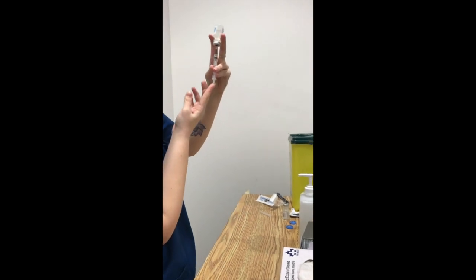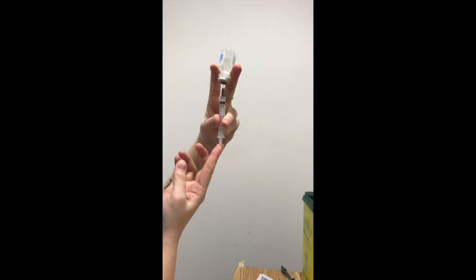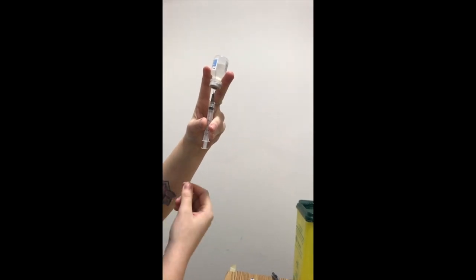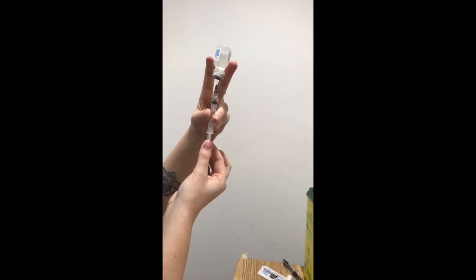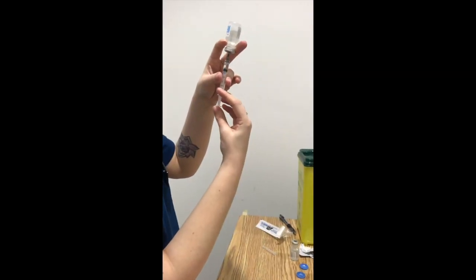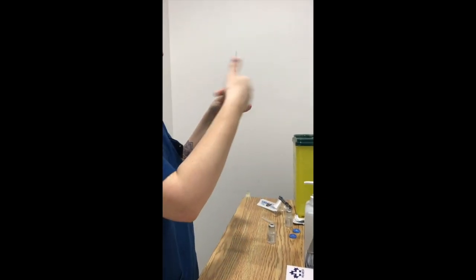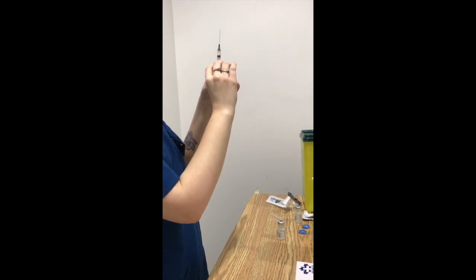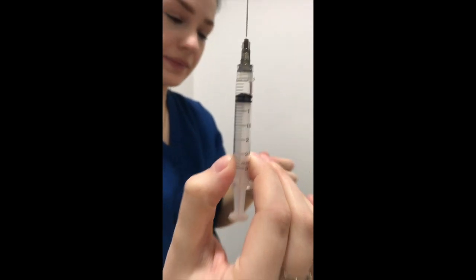And then we'd want to make sure that the tip of the needle is below the level of the fluid. So you can see that the level of the fluid kind of stops towards the top, and then the needle is below there. Then we're going to let go of the plunger and let it pull back by gravity a little bit, and then we're just going to help it along. So once we're at the 0.5 mL, we can just pull back on that. Tap out any air bubbles. Make sure we're right there. And then we have the 0.5 mL for injection.